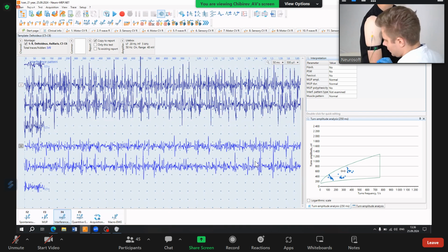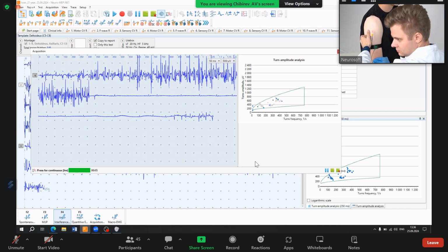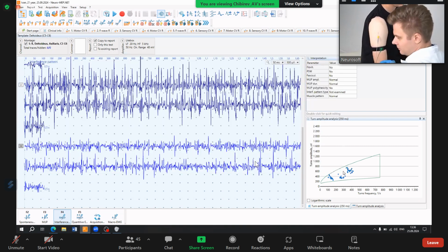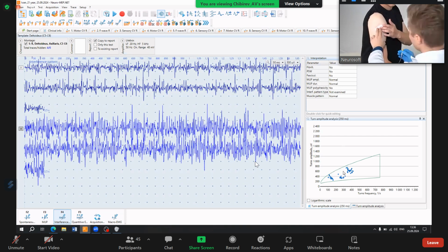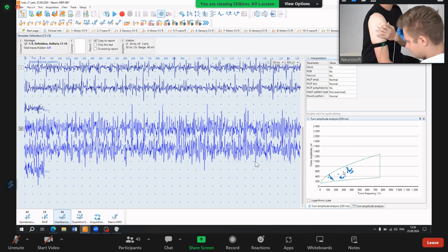And one more recording. Please try to do your very best. Yeah, we will see a full interference pattern and save the data. Okay, that's enough. Let's eject the needle out of the muscle and use a tissue. Thank you for your patience. I appreciate it. And data acquisition is done. Now we need to estimate the data we've got.